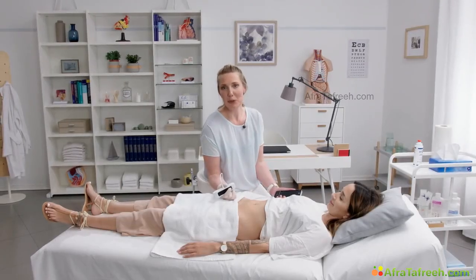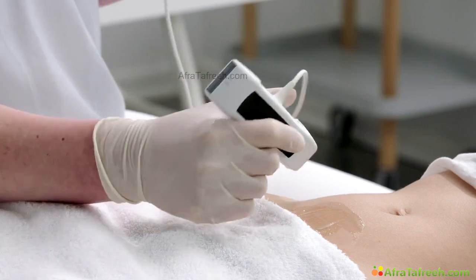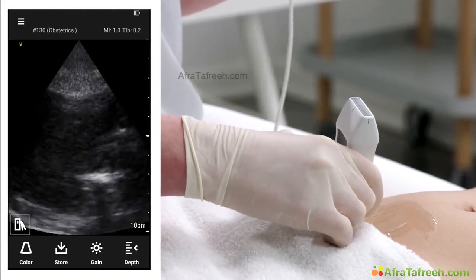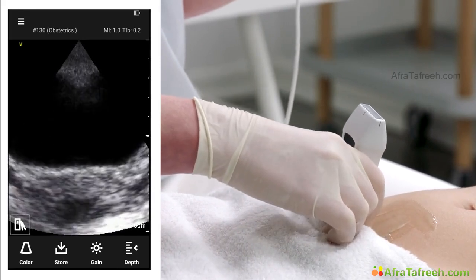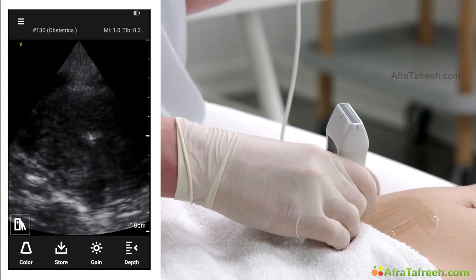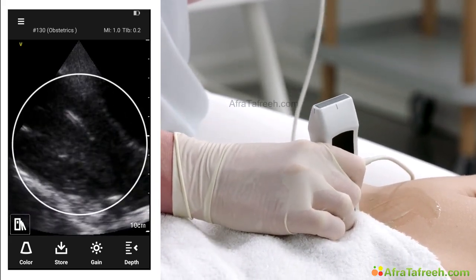Here again is a beautiful example of what we can see with primary care ultrasound. We start again straight above the pubic bone in a transversal plane, and here we see the filled bladder. This is the top of the uterus, so if we rotate now 90 degrees, we find the full uterus.